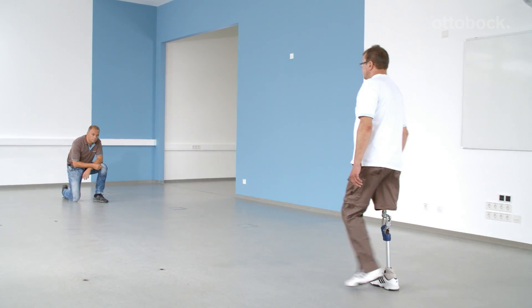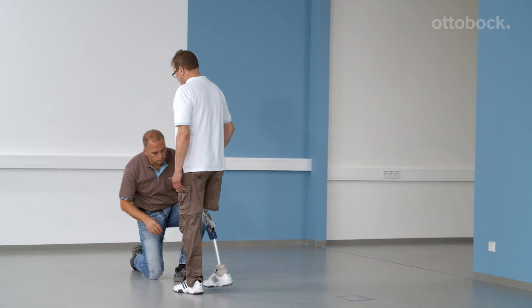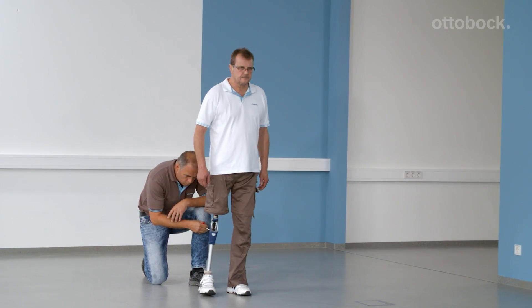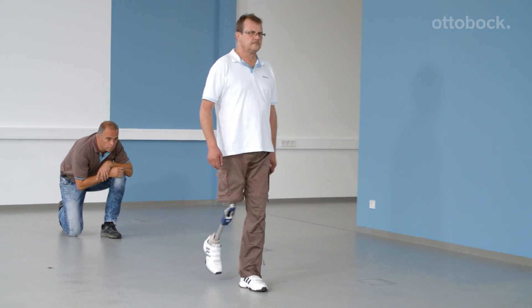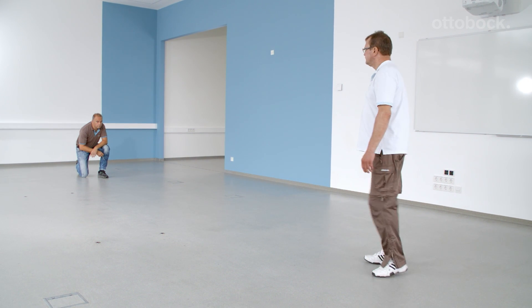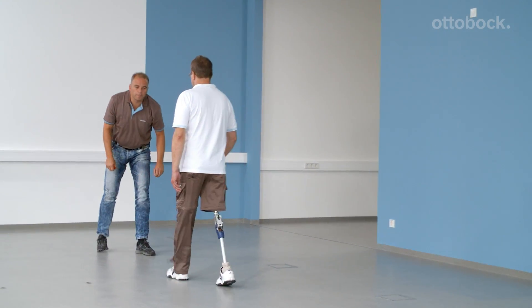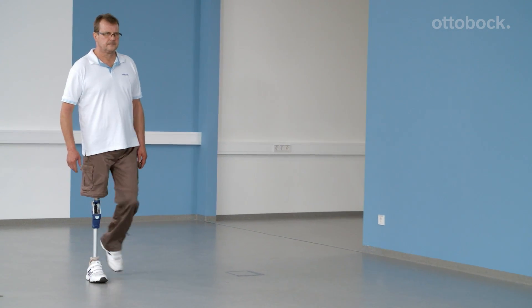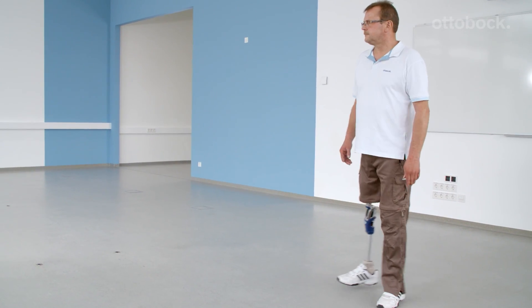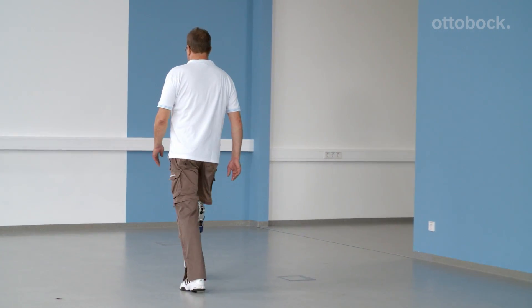At this point, the last check of the dynamic fitting is performed. The knee axis friction is tightened a little bit so that the extension stop is softer. Now the knee is set optimally for the user and further walking exercises can be completed.